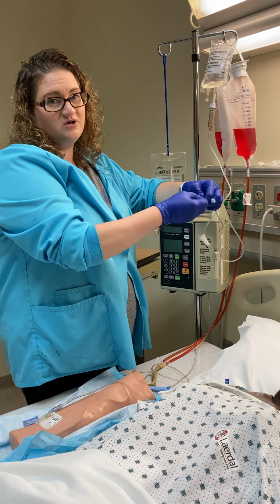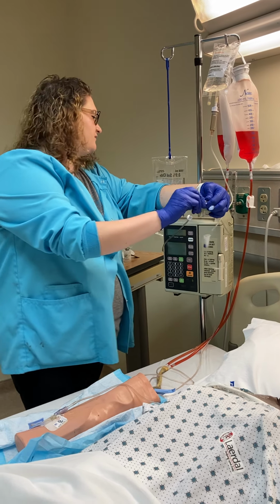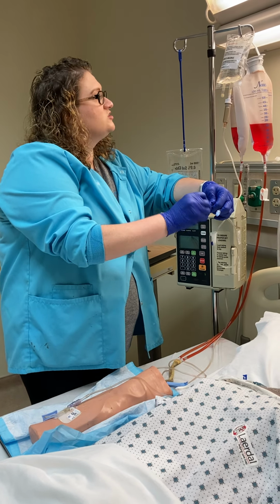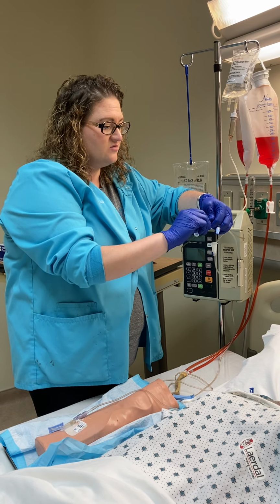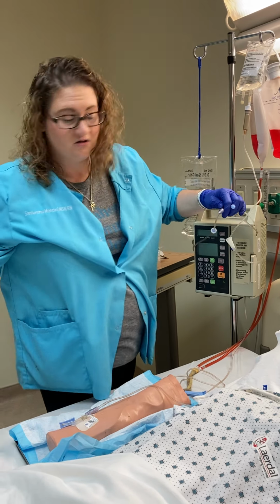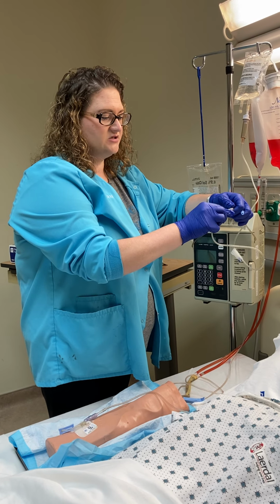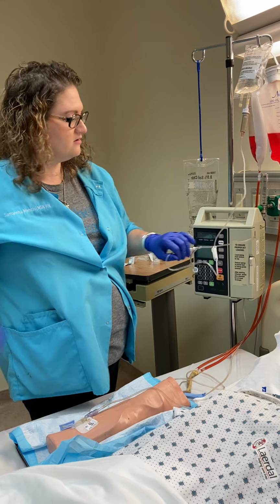Again, we check compatibilities with these medications. If an antibiotic or whatever is not compatible with your solution, you're going to use just a regular primary line to run that medication. Piggyback lines are only if it's compatible with whatever your solution is that you have hanging. So I do a 15-second scrub, allow it to dry, and then I am screwing that onto your luer lock.